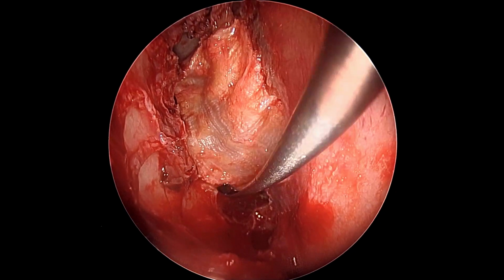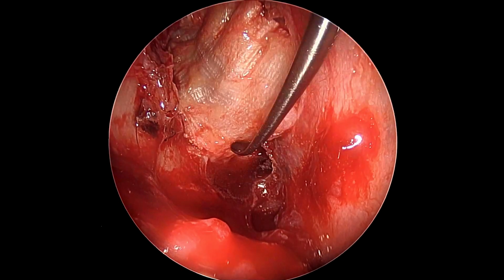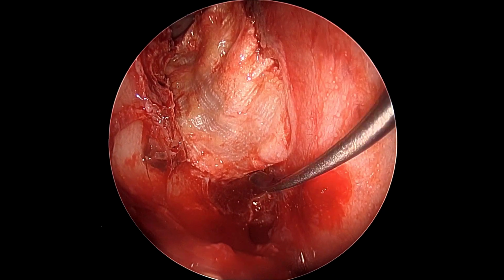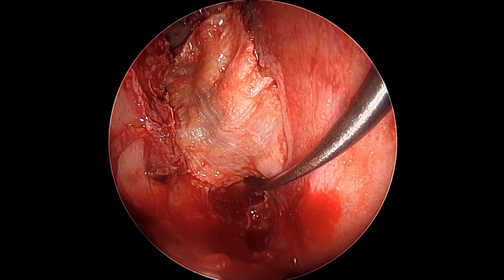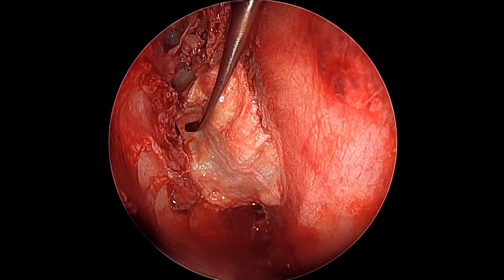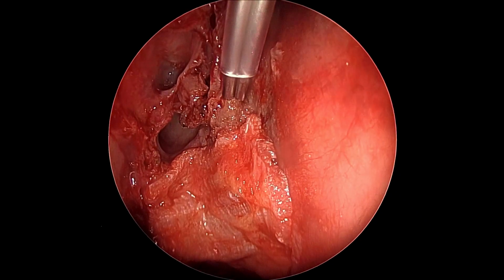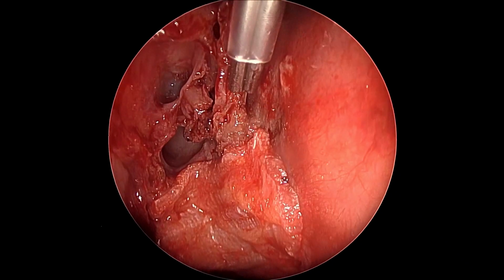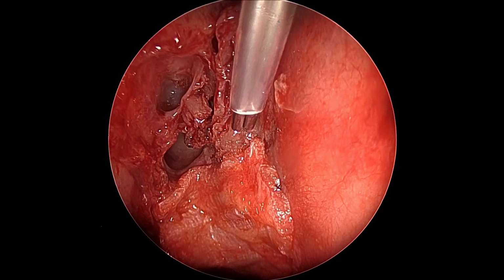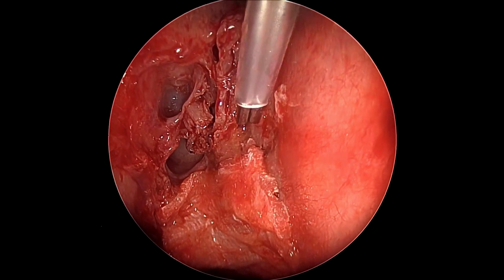The fat must be generously covered with the fascia. Also, the fascia must be in good contact with a lot of bone surface around the defect for this fascia to take up and stick well. This fascia requires bare bone to adhere. So as we can see here, our sphenoid and our frontal sinuses are well open. There seems to be no problem. The fascia graft is well covering the fat, and well in approximation.